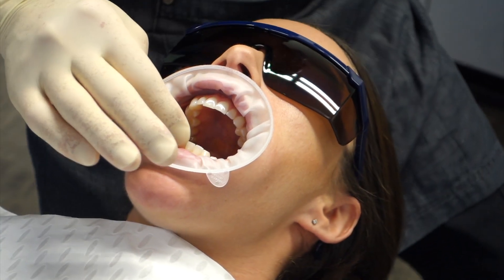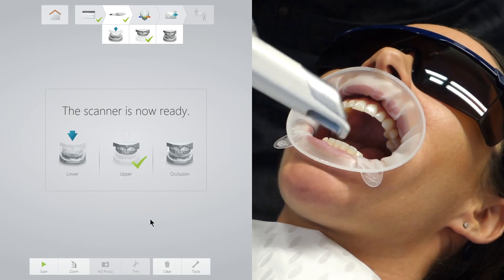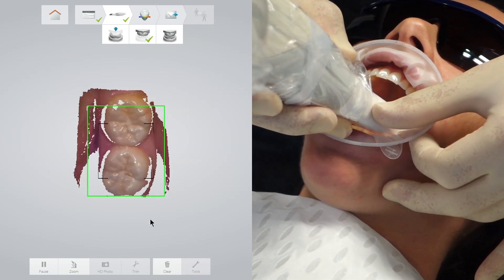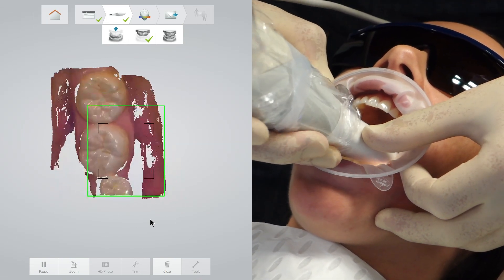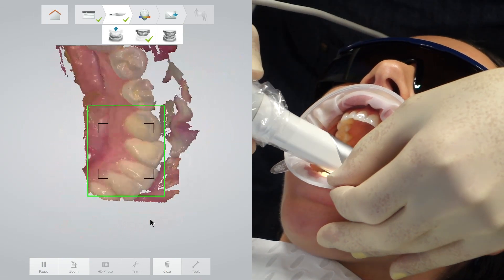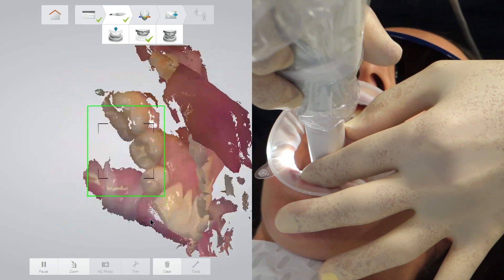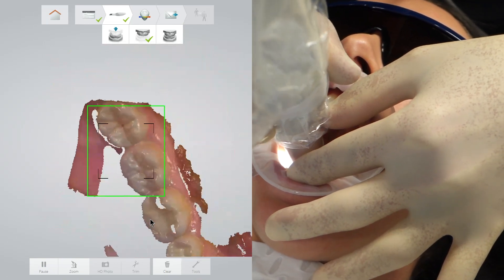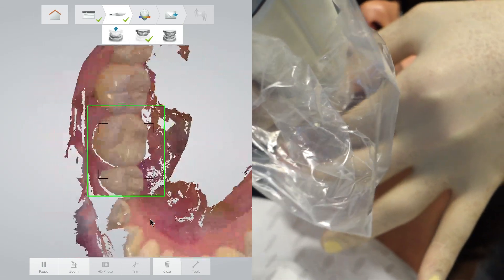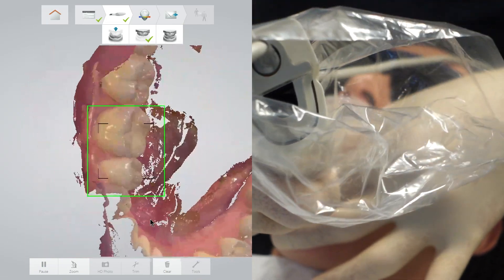We are now going to move on to the lower dentition, which can be more difficult given the tongue and its movement. The learning curve with this digital scanner has been very steep and at times seemingly insurmountable. The two basic premises I have understood are that the scanner needs to know exactly where it is — so a good base of tooth structure must be created — and secondly, any unwanted movement totally confuses the entire system. It is for this reason that I use the OptraGate and don't often use a mirror or cotton roll to retract the tongue. Instead I use the tip of the digital scanner to push the tongue away.